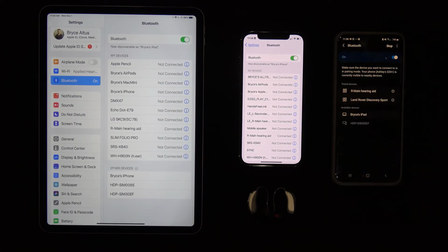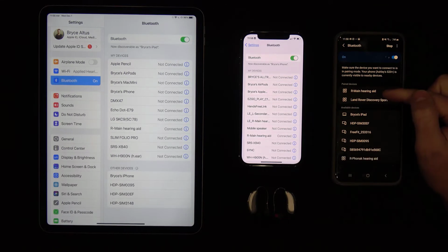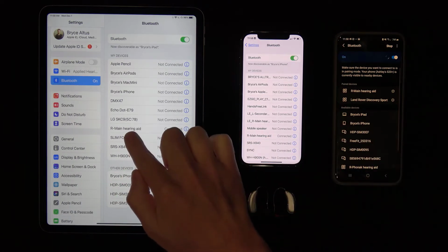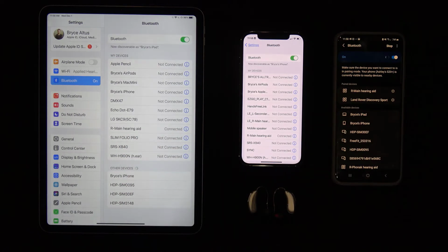If you have already paired your hearing aids with any of these devices, you should see the words either right or left Phonak hearing aid. You might see main Phonak hearing aid, or you might actually see your name listed in the My Devices section or Paired Devices sections on any of these devices.